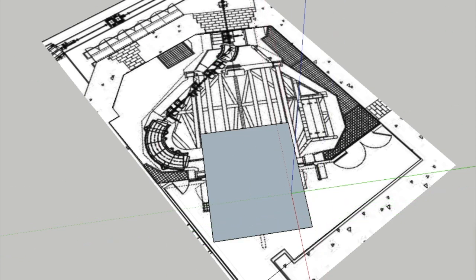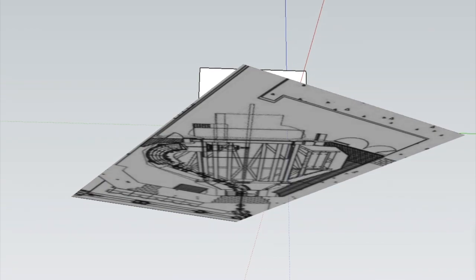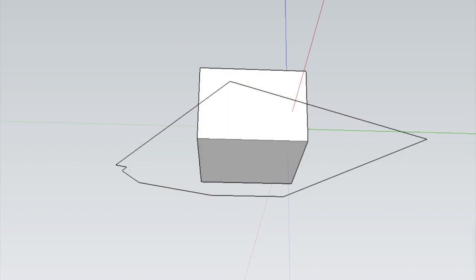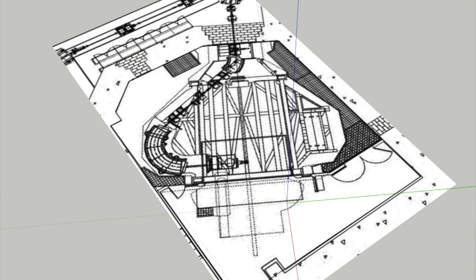The blue area is now that rectangle shaded, and we're going to expand that in 3 dimensions by pulling the blue area up another 6 feet above isocenter, and we're going to also pull it down by another 4 feet below isocenter, which will give us a total ceiling height of about 10 feet, which is adequate for the upright treatment room. So what we have there now is the volume that we need to treat a patient either in a Gantry or in an upright treatment room.